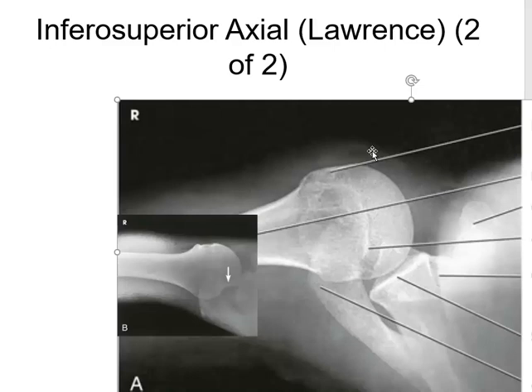So the textbook says, and the PowerPoint says, turn their head, but I'm telling you, have the patient turn their head and then tuck their chin to enable you to put the image receptor further into the patient's neck. So that's your glenoid fossa, that's your glenohumeral joint space, and your coracoid process is here behind the humerus, and that's really what it should look like.